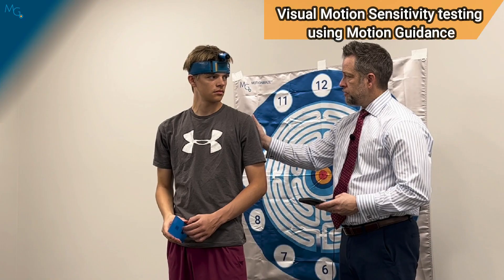Any dizziness, headache, bogginess, nausea? For this test, I recommend you stay close to the patient, but you have to be slightly behind them because they might get significant symptoms with this particular test.